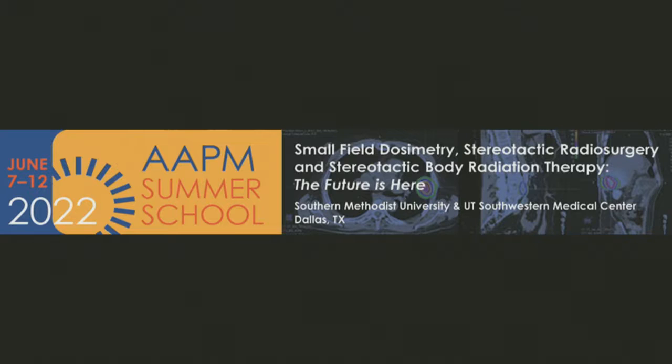So in order to do that, we need a very detailed fusion procedure, like CT to MR first intensity-based, and then prostate between MR to CT, we use fiducial-based, point-based. And then finally, if we want to introduce the lesion, we need to use multi-parameter MR. And there's no fiducial in those functional MRs. So we use contour-based.